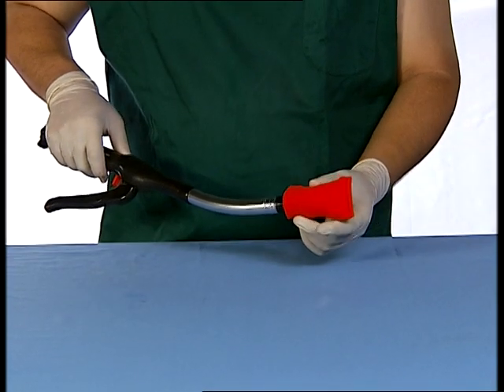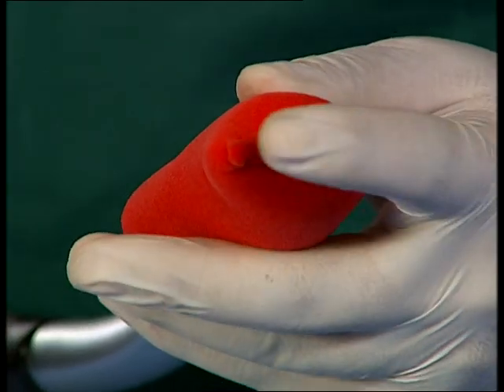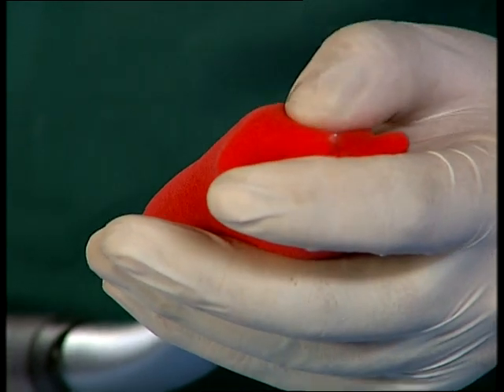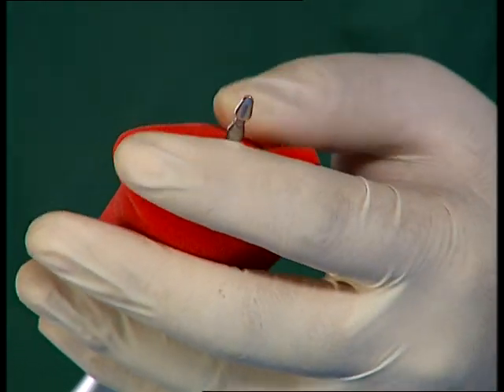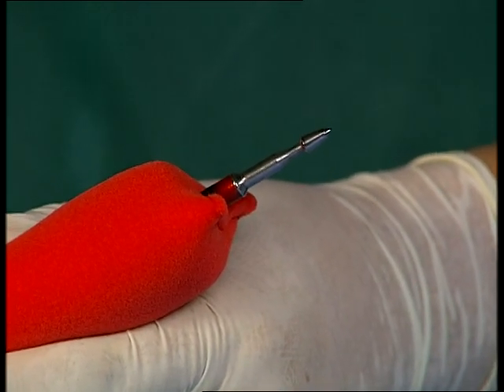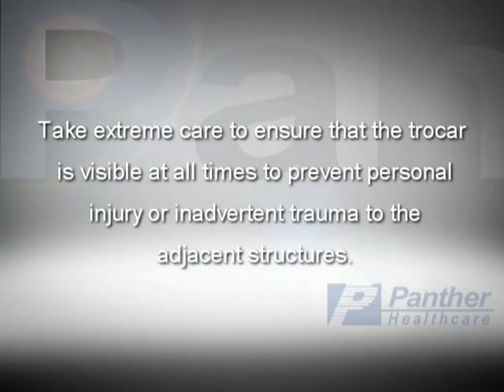With the trocar retracted, insert the instrument up to the closed lumen. Turn the wingnut to fully extend the trocar and gently rotate the instrument to pierce the tissue while holding the wingnut. Push the tissue down the trocar shaft until the red area on the shaft can be seen. Take extreme care to ensure that the trocar is visible at all times to prevent personal injury or inadvertent trauma to the adjacent structures.